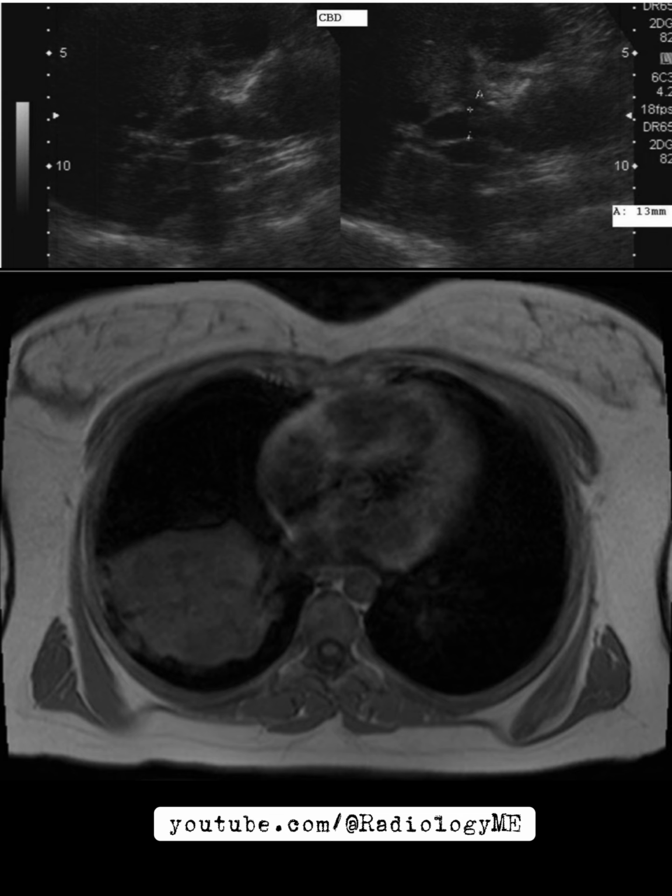And here we see that the common bile duct is dilated to 13 millimeters, far beyond what we would expect in a pediatric patient, where the normal range is around 6 millimeters. This degree of dilation clearly indicates a downstream obstruction.